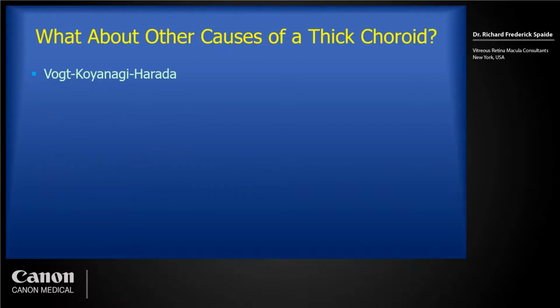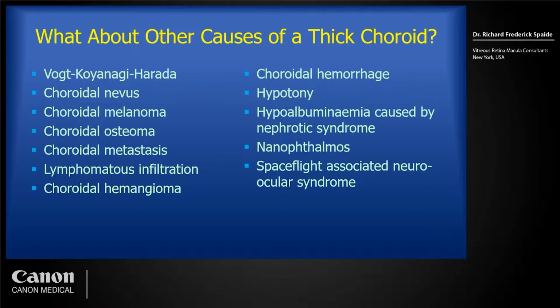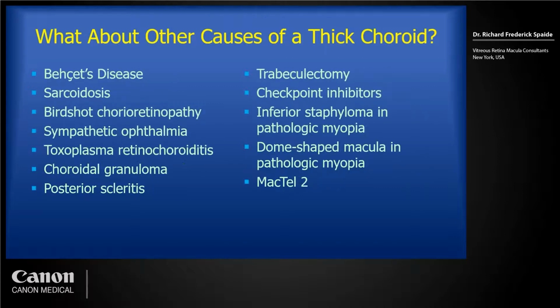Well, what about Vogt-Koyanagi-Harada syndrome, a cause of a thick choroid? Or what about these causes of a thick choroid? Or these causes? Or these causes? None of these are considered to be part of the pachychoroid spectrum.